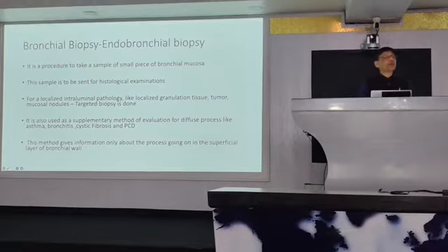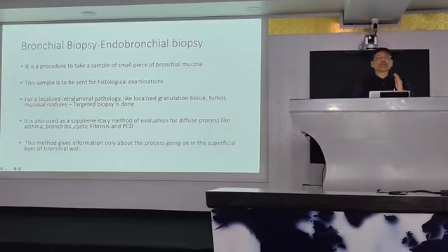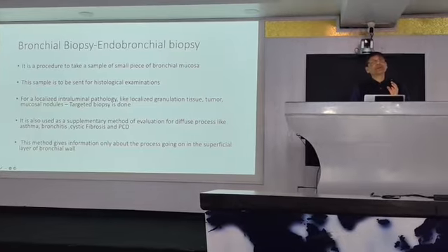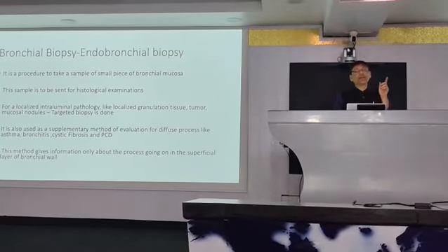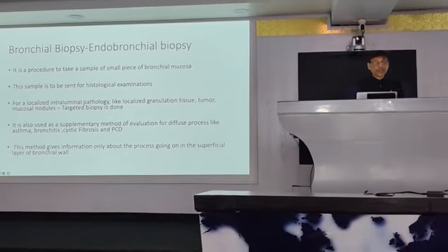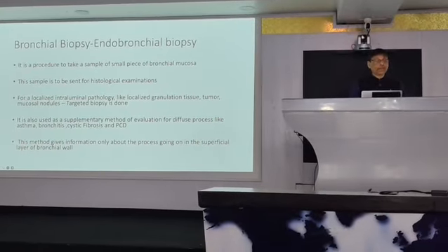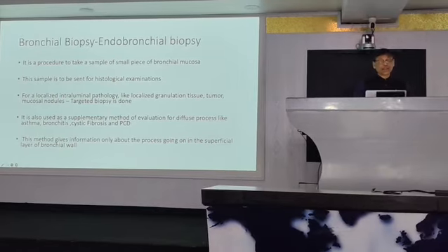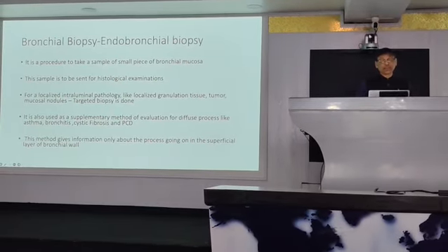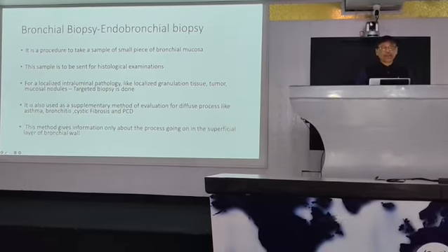Second is endobronchial biopsy. So brushing is just brushing of the superficial layer. Endobronchial means what? From the bronchial surfaces. Endobronchial will not cross the bronchial surface. So it is a procedure to take a sample of small pieces of bronchial mucosa. This sample is to be sent for histological examination for a localized intraluminal pathology like localized granulation tissue, tumor, mucosal nodules. Targeted biopsy is done.